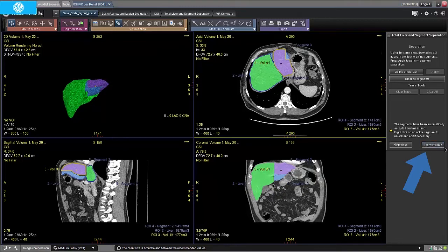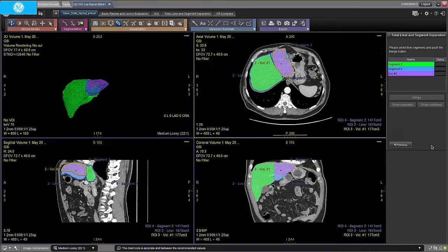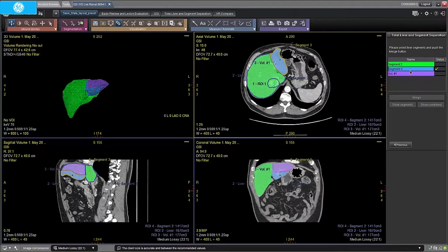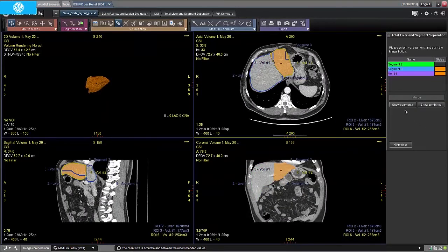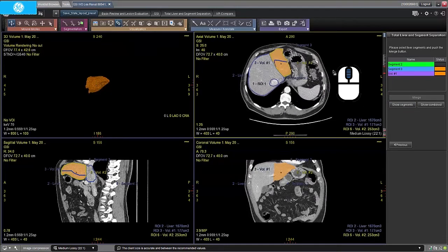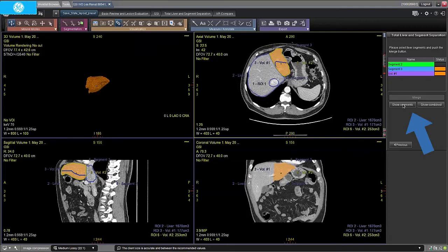Clicking Protocol Card Segments ID, the user has the capability to merge and display the segments or separations as desired. In this case we will merge segments 2 and 3 to display the results for the left hepatic lobe. The user then has the option to show the results for the segments or the combination by selecting Show Segments.